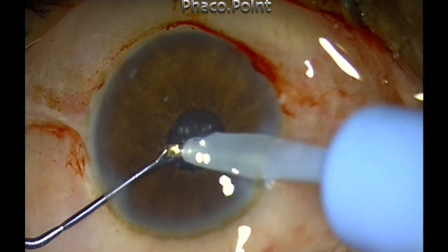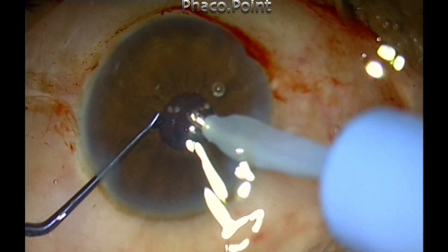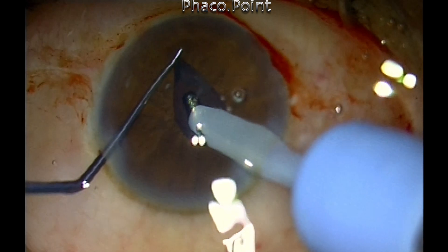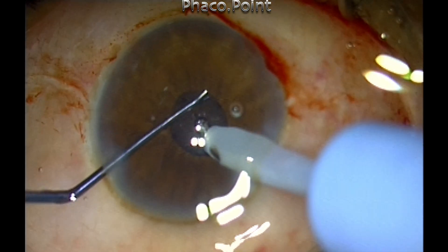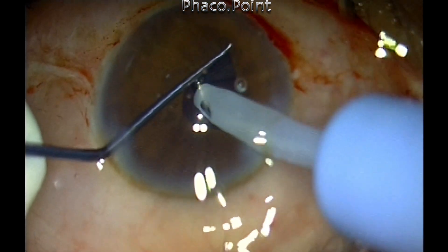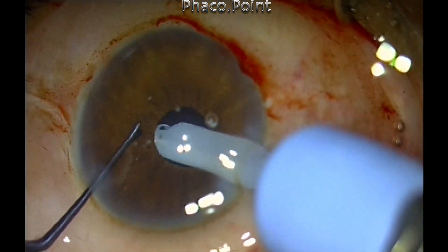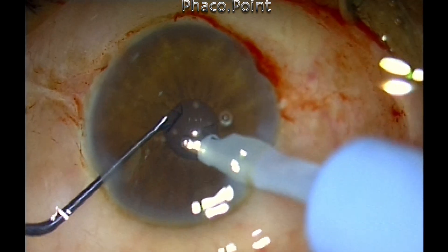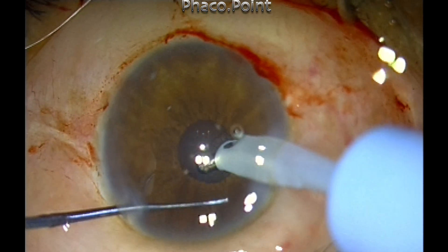The removal of cortex is not going to be easy without retracting the iris, so you have to retract the iris, visualize the cortex, and then aspirate it. The device that works best in my hands is a Y hook. You can also use a Kuglin's hook. A Sinski hook will not fit the bill, because the iris tends to slip over the Sinski hook and therefore it's not an ideal instrument to retract the iris.